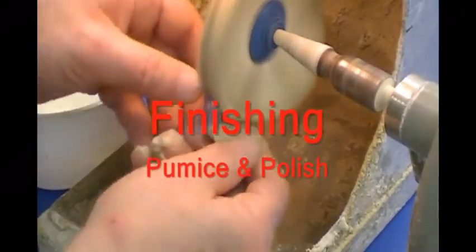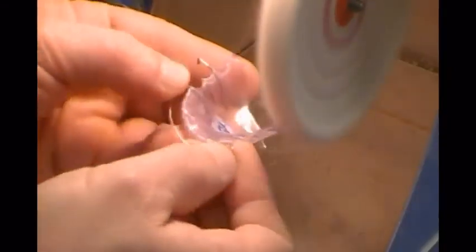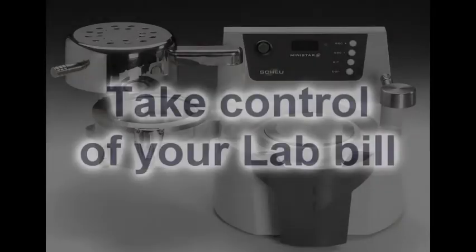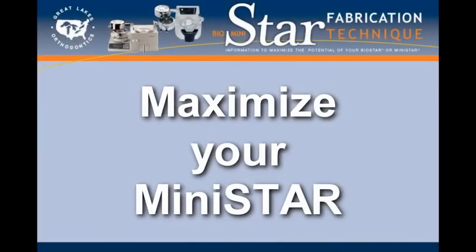This retainer is pumiced and polished using the same procedures outlined for the upper holly retainer. These technique videos, along with the other information on the Resource Center, can show you how to get the most from your machine and how to ultimately take control of your lab bill. Maximize the potential of your MiniStar.